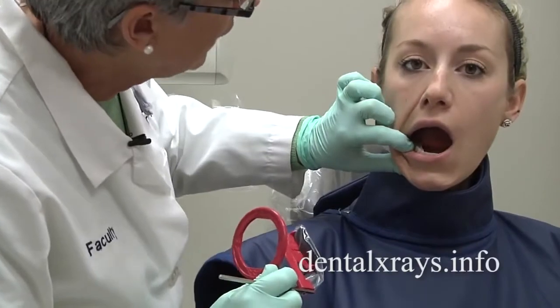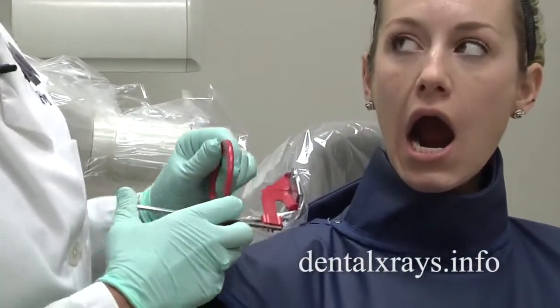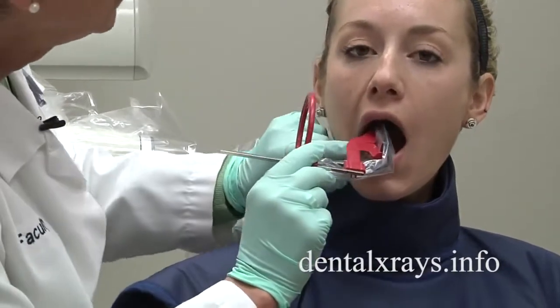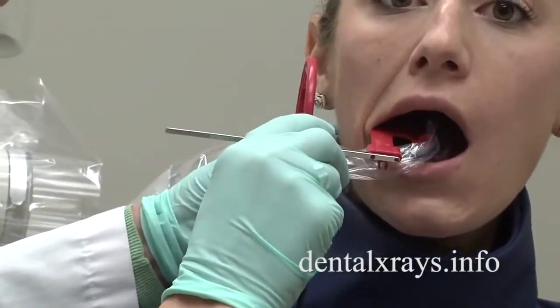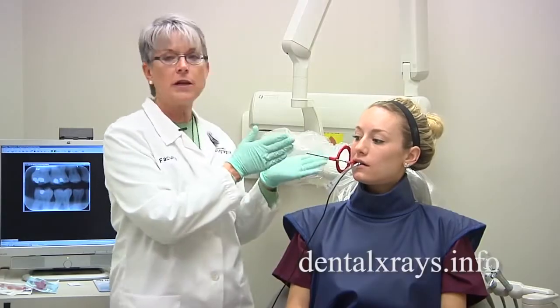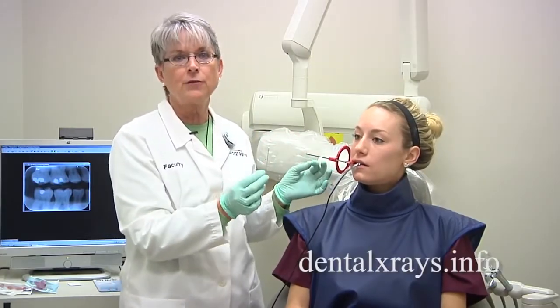So if we open up her mouth and I look at this, often the molar view isn't going to require anything except moving it toward the middle, putting the distal of the second molar on, having her bite down, bringing the cone, and taking that. That's all you need to do for the molar view.